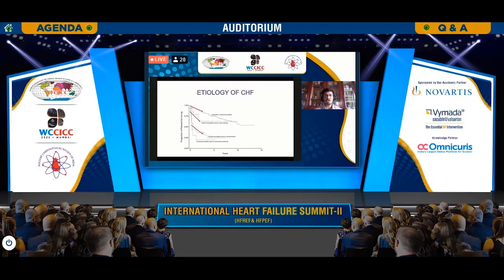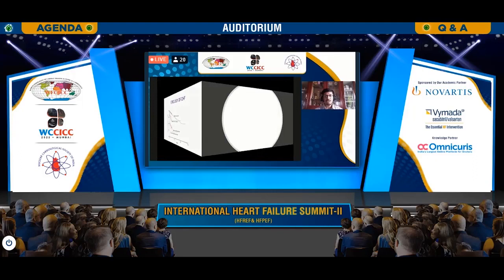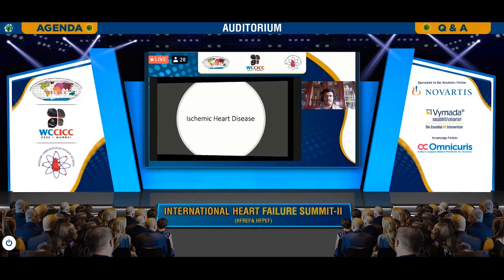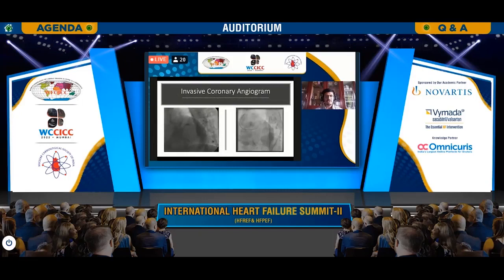Shifting gears to the etiology of heart failure, we know that heart failure is a big basket of multiple etiologies, from idiopathic to sarcoid to amyloid, and we need a technique that can really look at all of these. But if you look at Felker's data, we can clearly see that heart failure is basically two things. One is secondary to ischemic heart disease, which we have traditionally evaluated by a coronary angiogram, a normal coronary angiogram on the left and an abnormal one on your right.